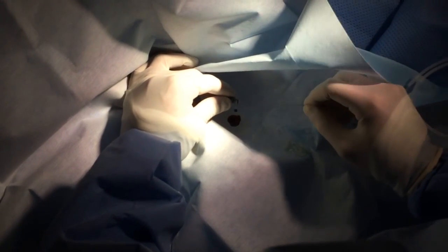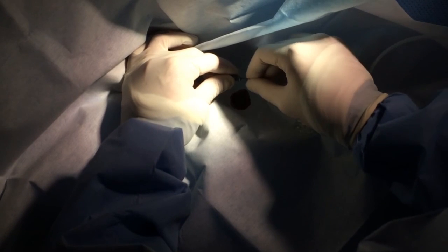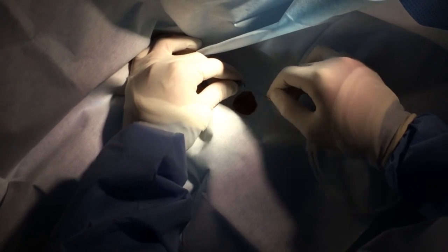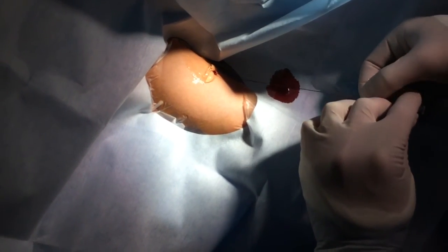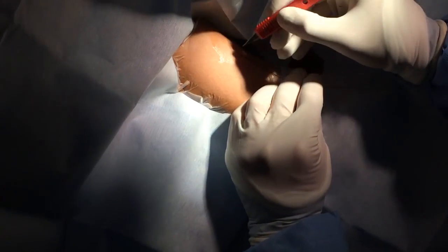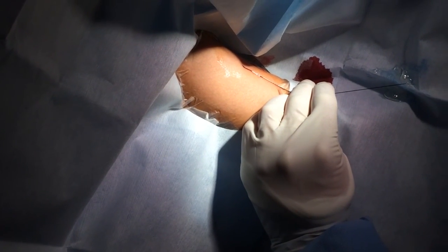We know we're patent in the middle of the vessel, so we'll put that floppy wire in. Advance about halfway of the wire. Going nice and smooth and easy. Great. Needle comes out. Tourniquet goes down. We didn't show that part, but you'll take down the tourniquet now. Little nick right over the wire. Be careful. The vessel usually is pretty close to where the wire is on these midlines.